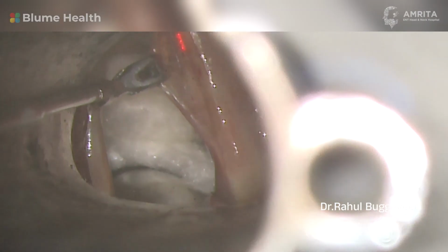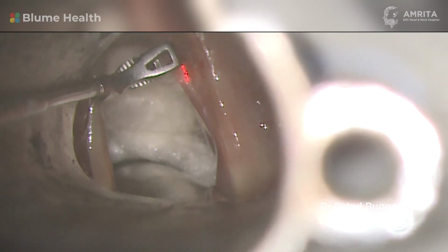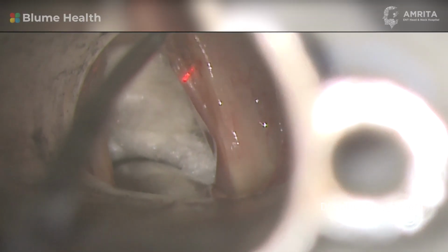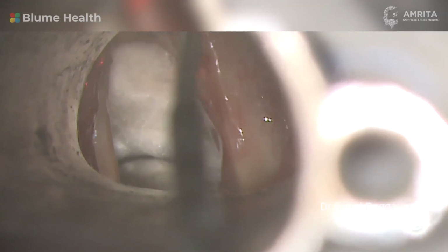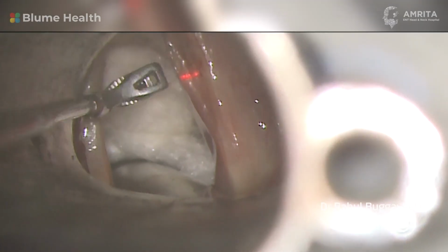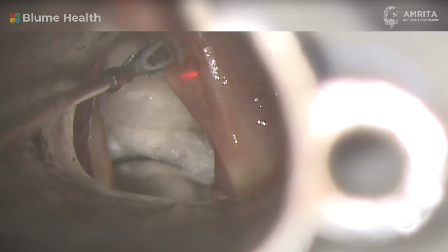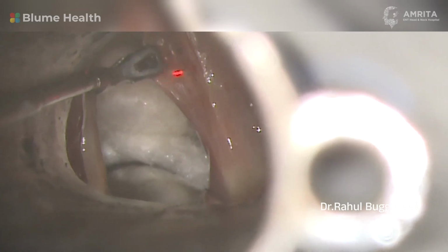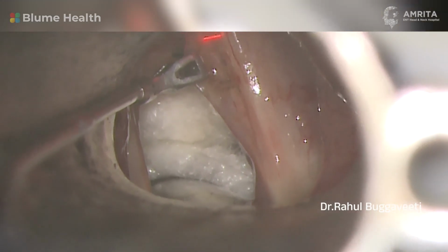Laser cuts are given separating the wall of the cyst from the vocal fold mucosa. The advantage of laser is there won't be any bleeding and you can dissect the tissues layer by layer and you get a precise cut. There won't be any lateral damage to the tissue. So the ultimate voice outcome is better with the laser.